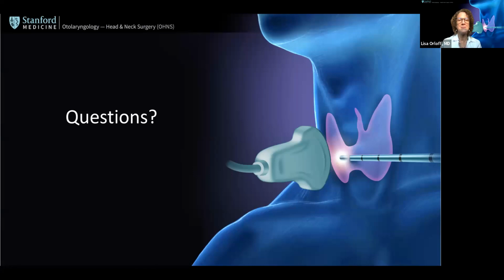The superior parathyroids and the deep parathyroids aren't going to be RFA candidates anyway, but the technique involves a lot of hydrodissection around the parathyroid to try to minimize collateral damage. And yet I think there's still a very real risk of parathyromatosis or seeding of neoplastic parathyroid tissue into the neck, which would make this a procedure that should be approached with great caution.